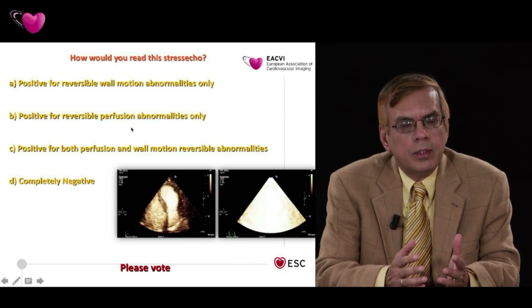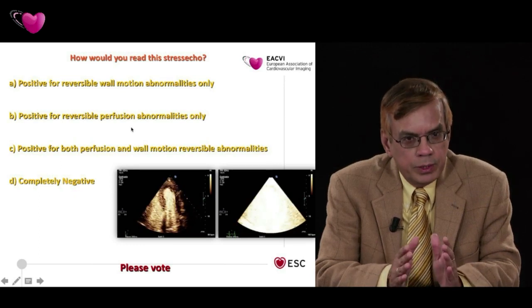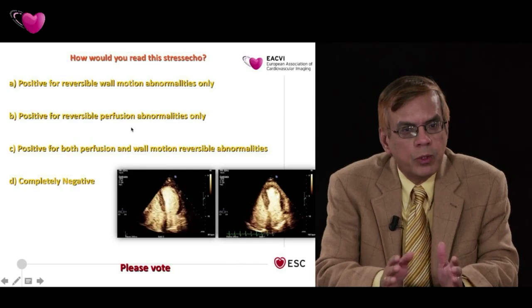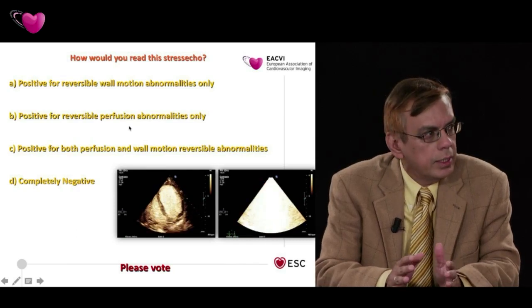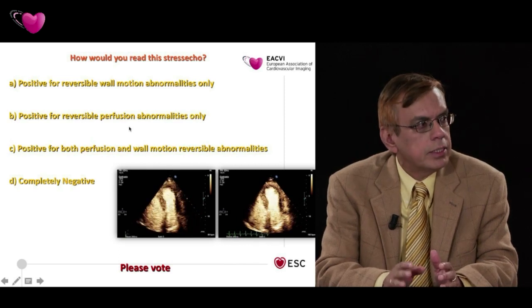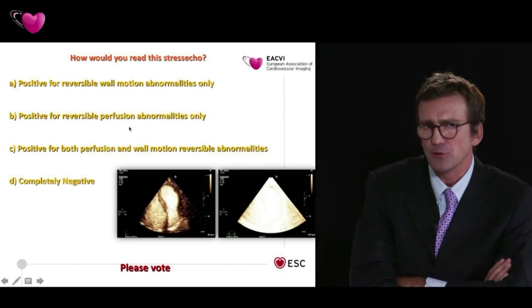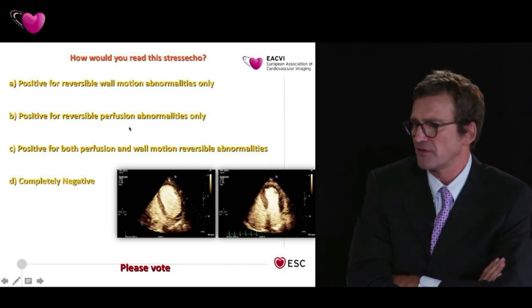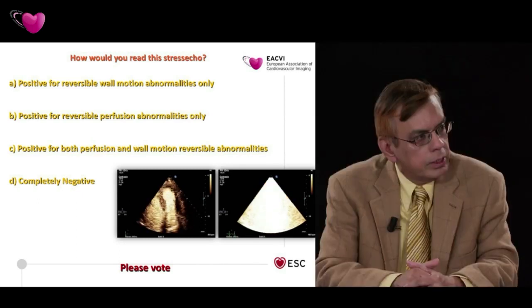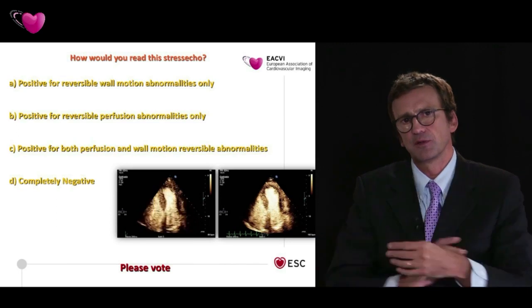I think we need to highlight this, Nicola, that we said it before, but I think we need to say it at this stage also, that with the setting that we have for stress echo, we get wall thickening data very clearly. So perfusion, we are not doing anything extra, but just pressing a button for flashing and looking at replenishment. Absolutely. It's a bonus. So do you do it in all your patients with stress echo? Definitely, yes, absolutely.